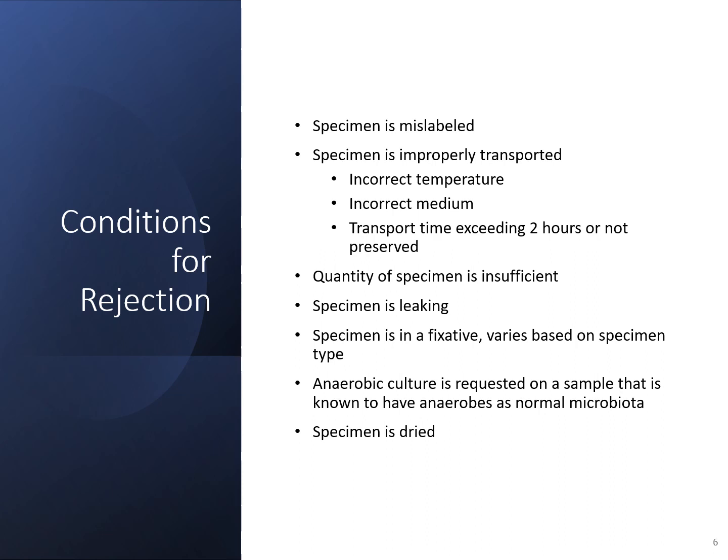If there's not enough specimen to perform the culture, or if the specimen has leaked inside of the bag, it could have been contaminated. If it's in a fixative, which will vary by specimen type, some fixatives will destroy the bacteria.